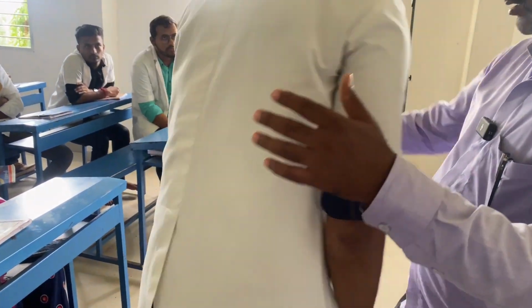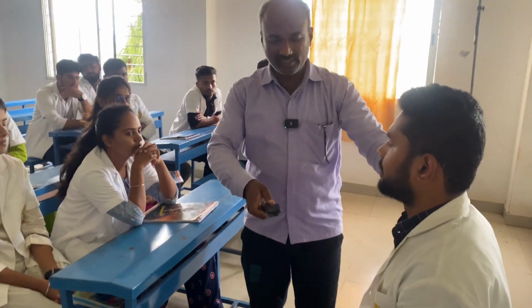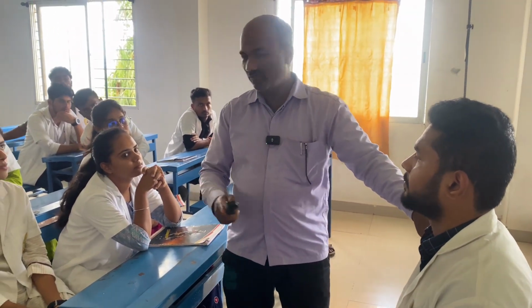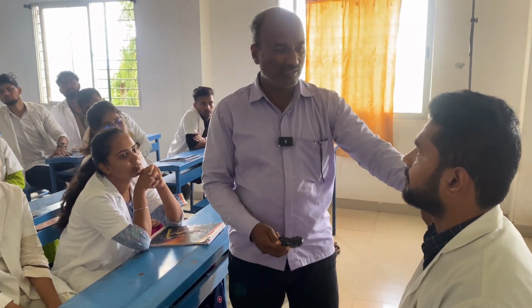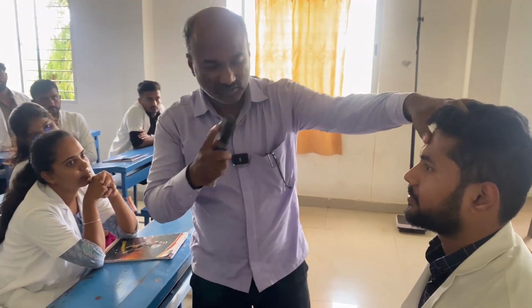Sit here, face this way. So this is a patient, right? Direct distance ophthalmoscopy begins at an arm's distance. Okay? Look straight, within an arm's distance.